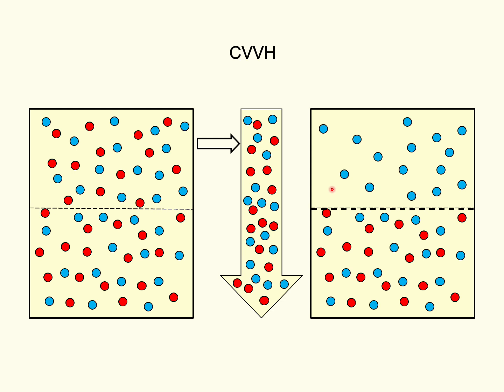If you want to decrease an unstable hypotensive patient's volume a little at a time, all you do is adjust the balance between the UF volume and the replacement volume. So in 1 hour, remove 1 liter, but replace it with 950 cc's. And over 24 hours, that hourly negative balance of minus 50 cc's translates to 1200 cc's per day, and so on.